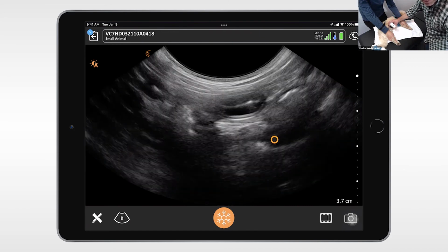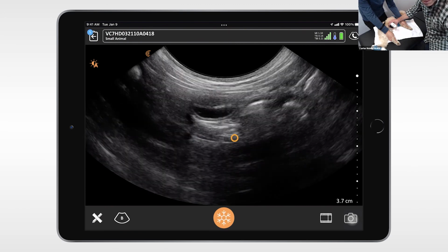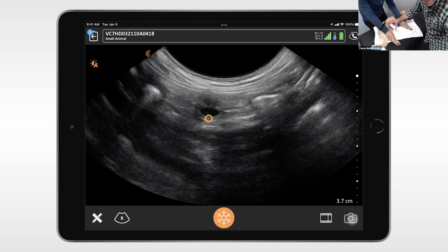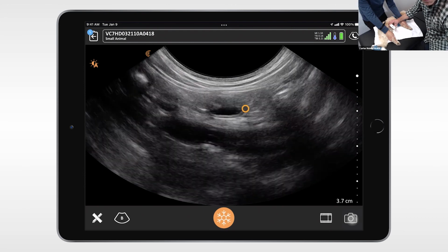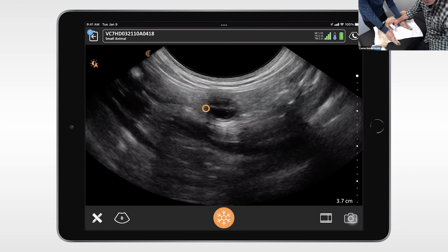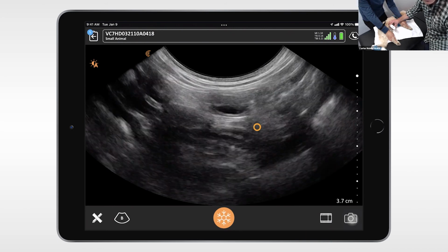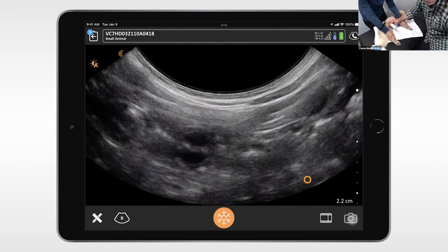All right. And towards the right of that, on the other side of the duodenum, you've got a little triangular structure. Here? Or screen left? Screen left. Screen right. Screen right. Yeah, just a hypoechoic area with an anechoic dot in the center.